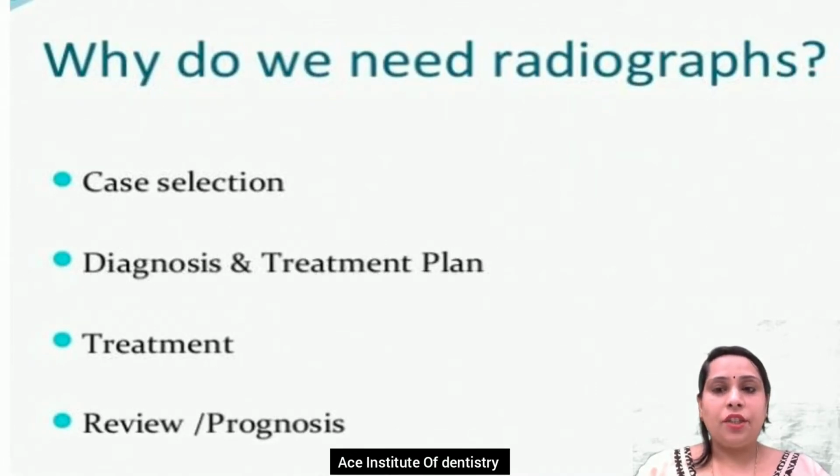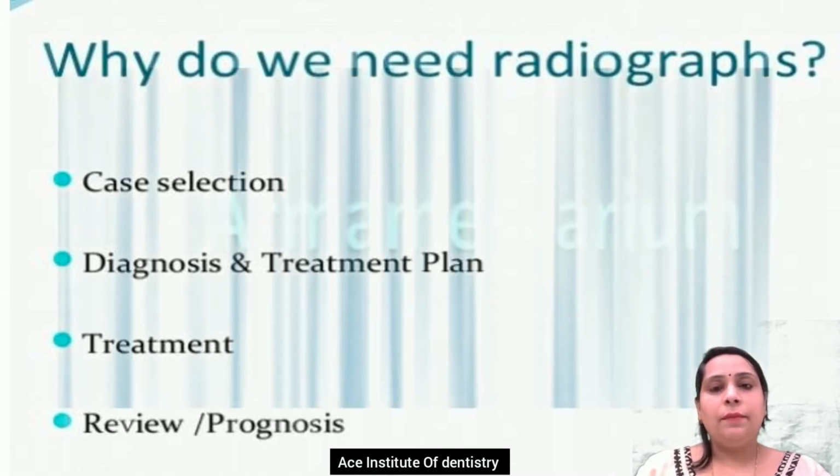Definitely for case selection. Which tooth has to go for RCT? Which tooth has to go for extraction? We can properly decide diagnosis and treatment planning. And for proper treatment, like during our endodontics, we can correlate how our apex is with a radiograph. And for review, if we have done any case with an abscess, we can see after 6 months how it has progressed or how the lesion has subsided. So that's the reason we need these radiographs.